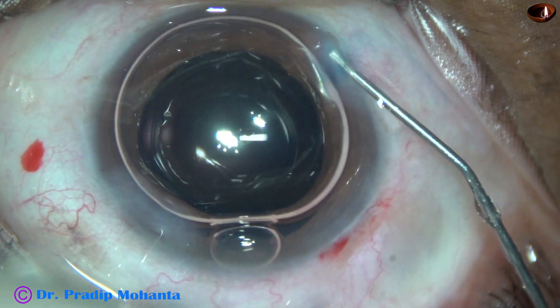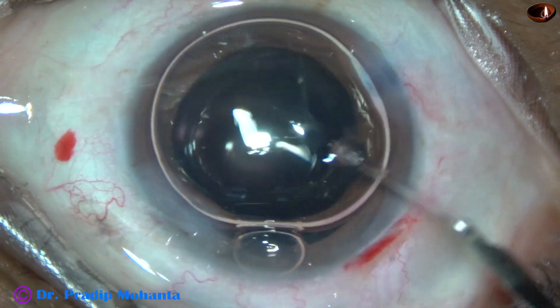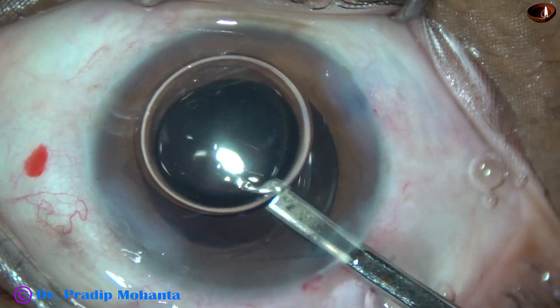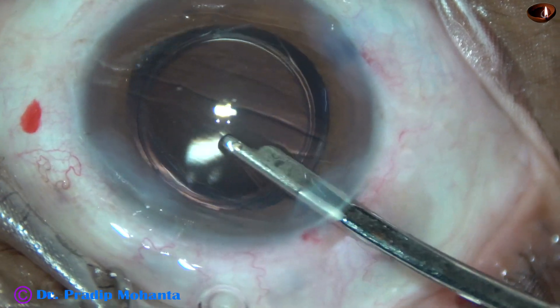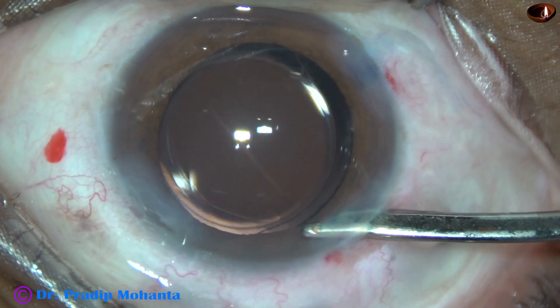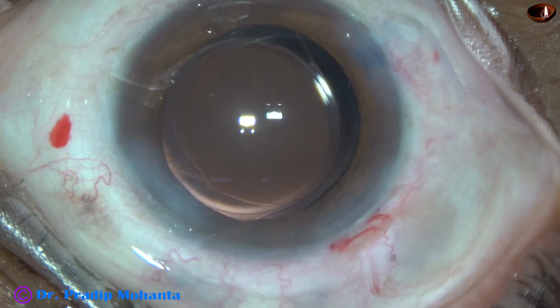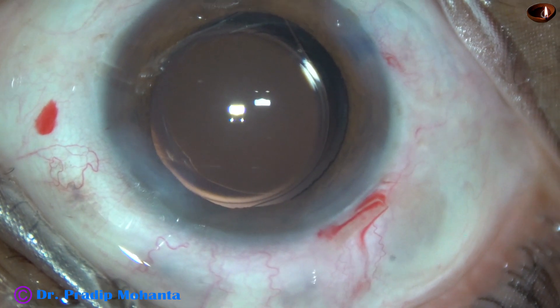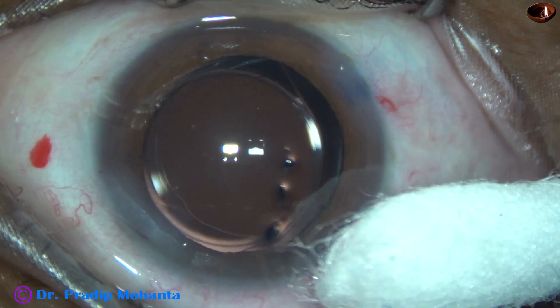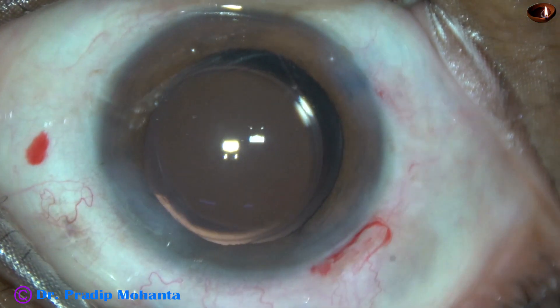And now a final lavage of the anterior chamber is done with the help of this 23-gauge Simcoe cannula. The anterior chamber is very nicely formed. Then the integrity of all the wounds is checked with the help of a cotton-tipped applicator. A few drops of moxifloxacin are applied over the ocular surface, and the case is concluded.